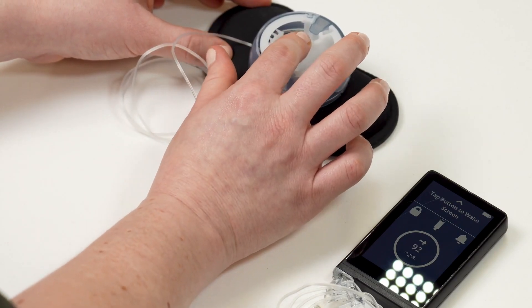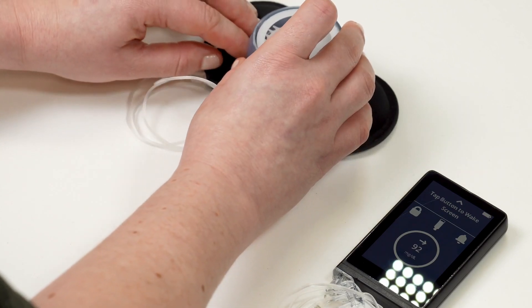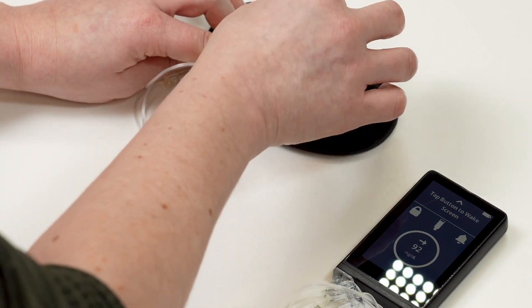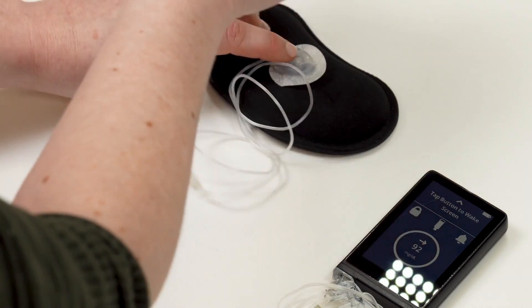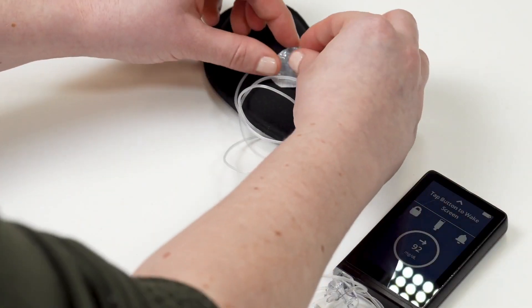Once it is inserted, gently push on the white handle of the inserter to help secure your infusion set. Grasp the handle of the inserter and pull straight backwards to remove the needle. Rub around the edge of the adhesive to make sure the infusion set is secure.